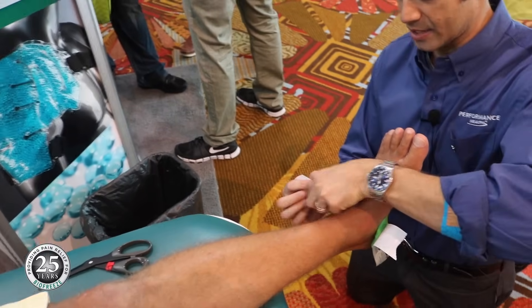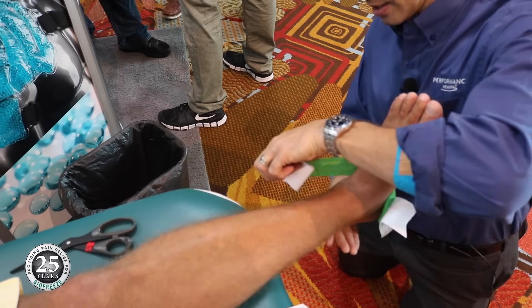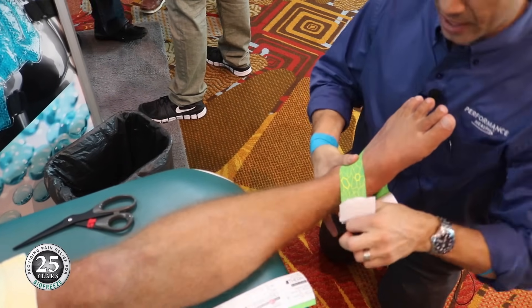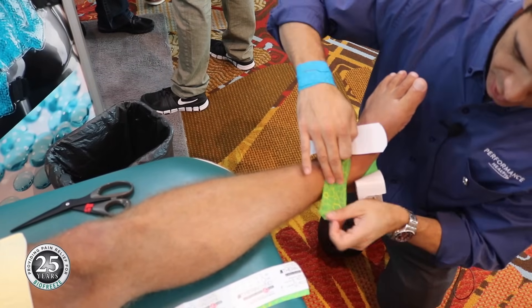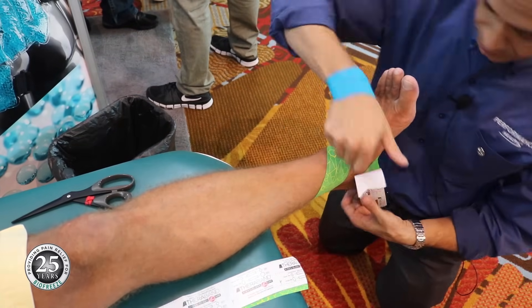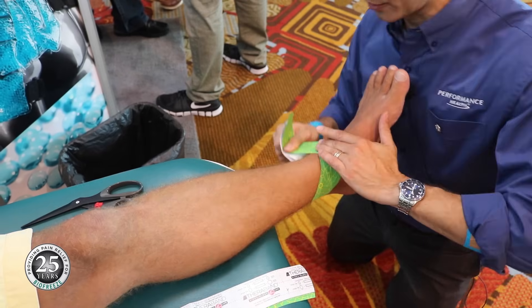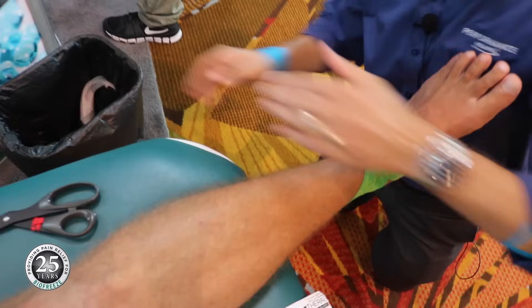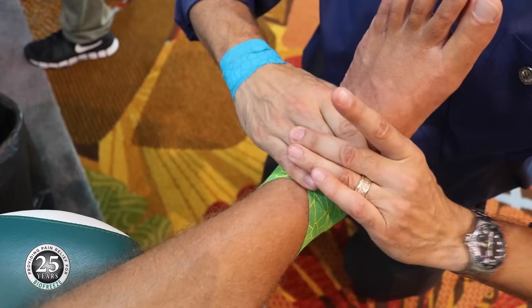Taking one tail at a time, using our exact stretch indicators, we want to make sure we get over that 50% stretch. Use the thumb to make sure we don't get any wrinkles, and then it's paper-off tension right at the end to make sure we don't create a compressive load that may compromise the vascular. Same thing on the other side — come right across, and then paper off the rest of the way. That's our first strip associated with the ankle mortise, helping to lock that in place.